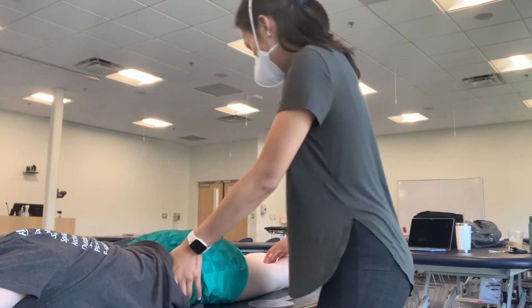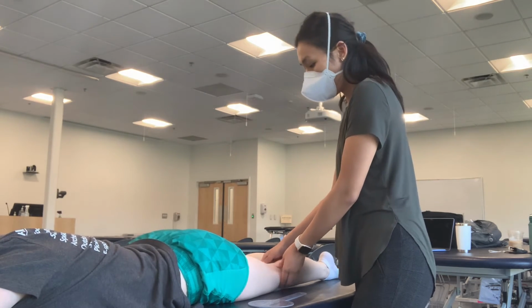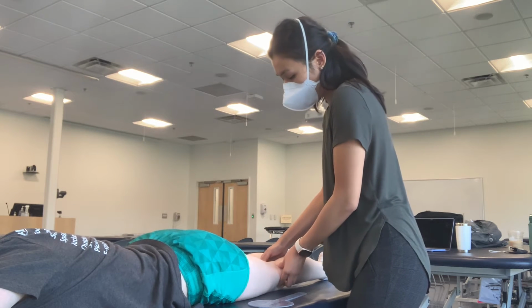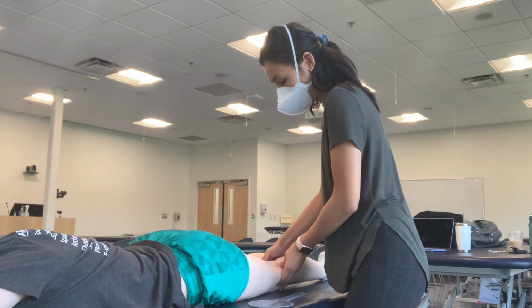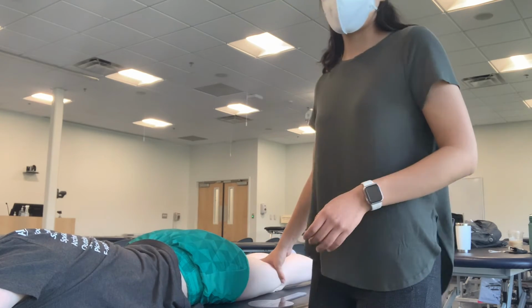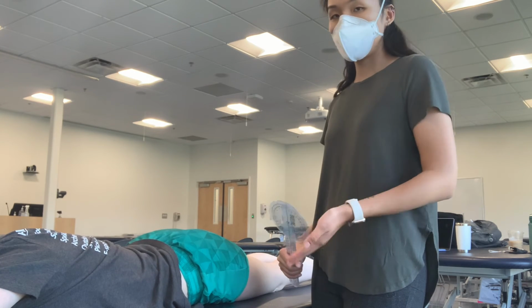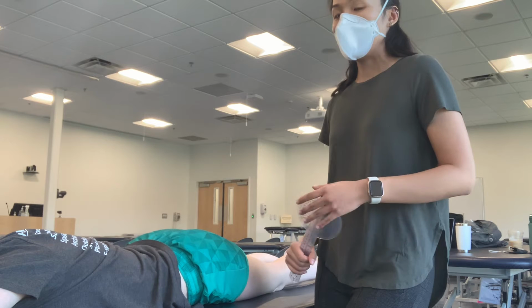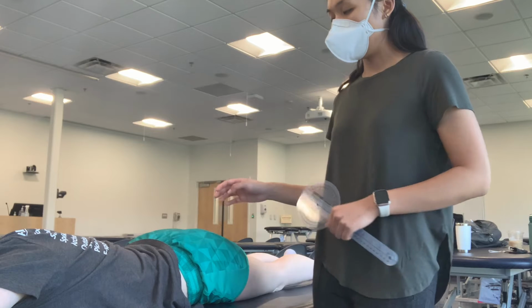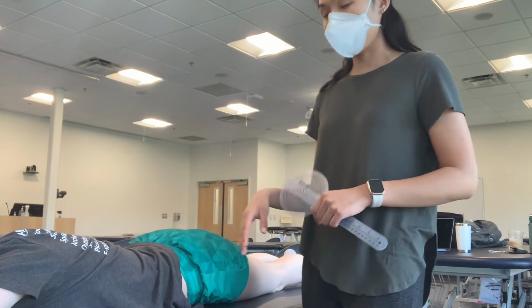And Katie is good. And then to test for 0 degrees of rotation, we want to palpate for the medial and lateral epicondyles of the femur and make sure that the patella is facing anterior. Okay, so she is also good there. For this test position, you can also place a pillow under the patient's stomach in order to help with comfort, but if you do that, you want to make sure that there's no hip and lumbar flexion.